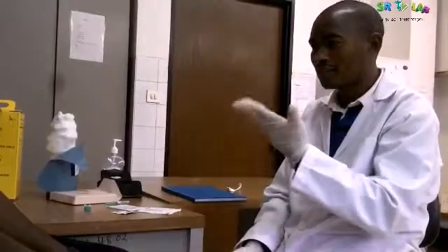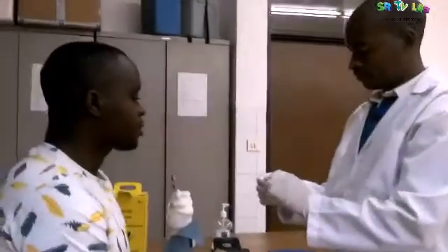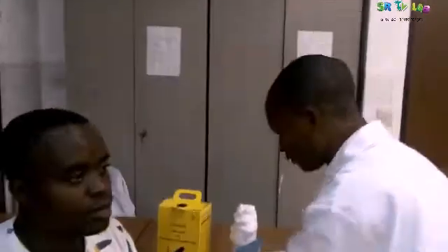Let's start with the bleeding time test. First of all, we have to make our patient feel comfortable. This is not harmful, it's not bad. Then we clean our patient's finger — that is where we are going to prick — and see how long it is going to take for the bleeding to stop.